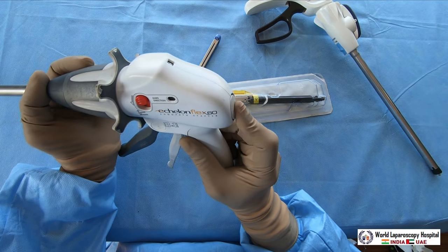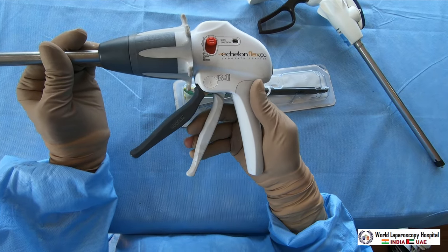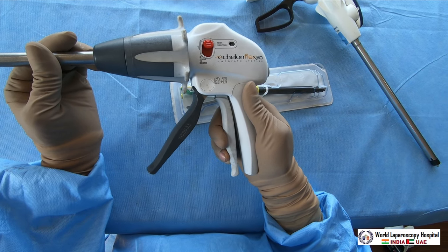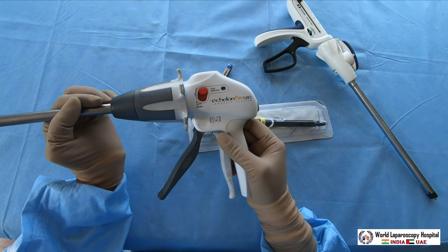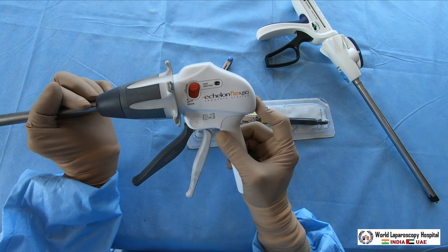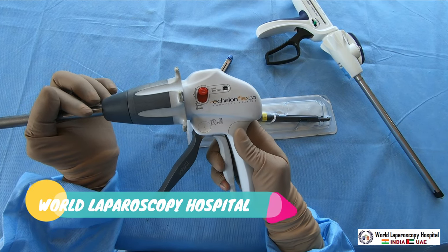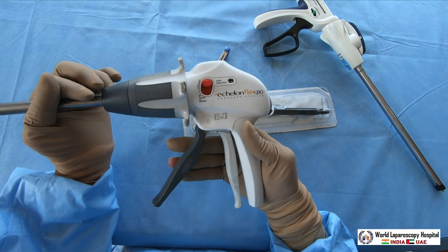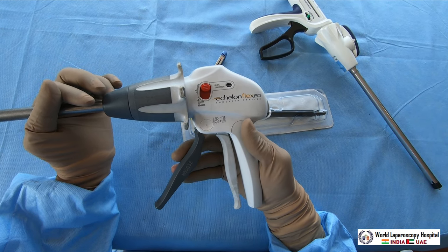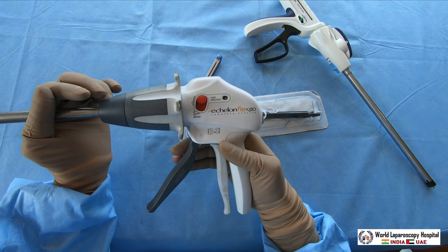As soon as you press the knob, it will open without causing harm. You can rotate it again and re-hold the tissue. If you are still not happy with the held position, you can press and it will open again. Once you are sure you want to fire, you press the firing button - each press gives 15 mm of progression.